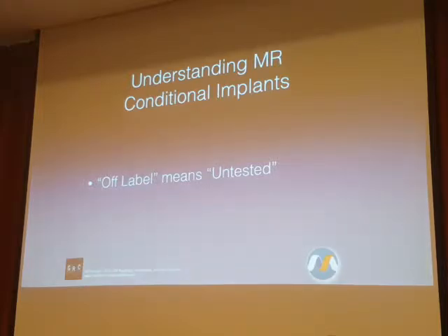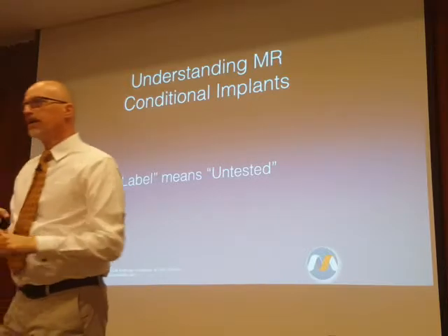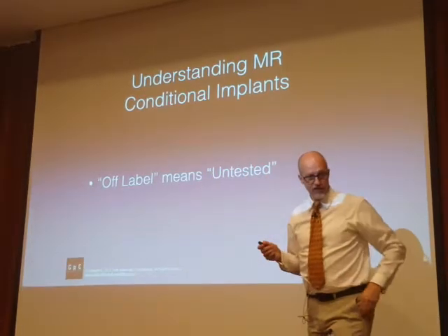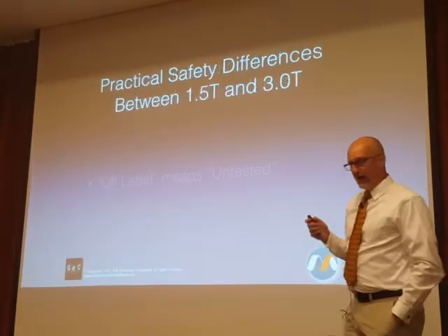So depending on where the device is inside the body of the patient, depending on how we're positioning the patient in the magnet for the study or studies that we're planning on doing for them, those things are going to dictate what the potential exposures are for static field and spatial gradient associated with it, the time varying gradient magnetic field, and the radio frequency magnetic field. So think about that, and I've actually got an illustration of that that's coming up here in a minute.